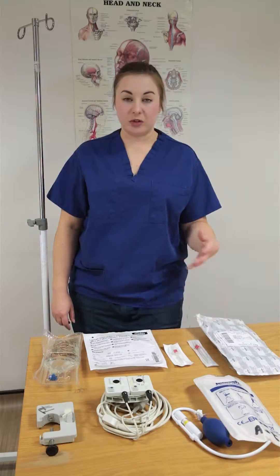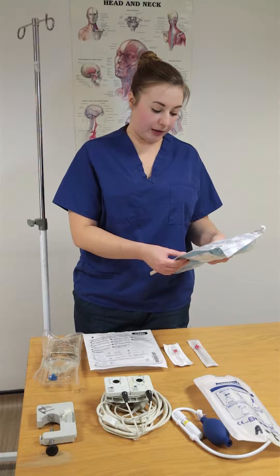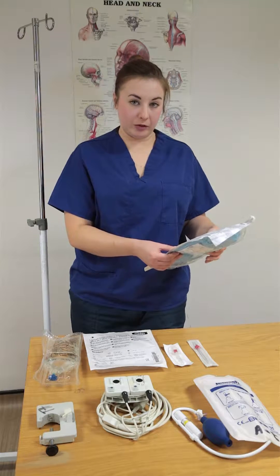If your trust doesn't use pre-packed arterial sets, the things that you'll need from it are one 2.5ml syringe, one 5ml syringe, one green needle, a couple of swabs, one arterial dressing, one chloroprep, and one drape.